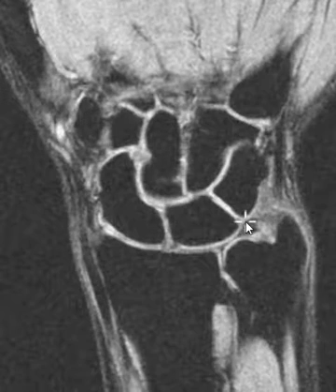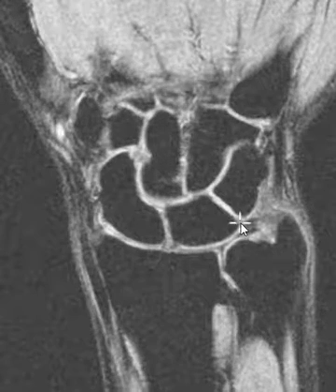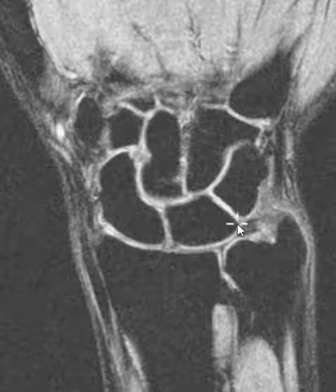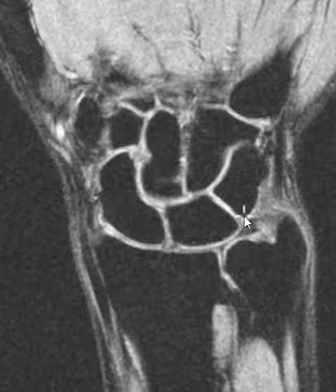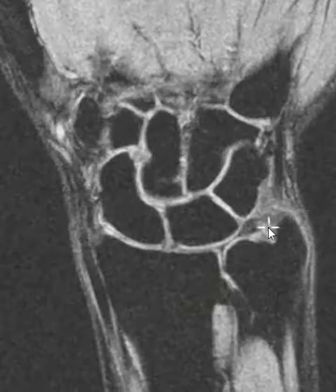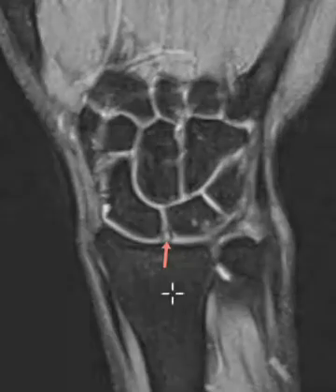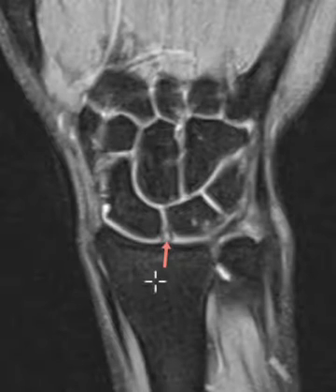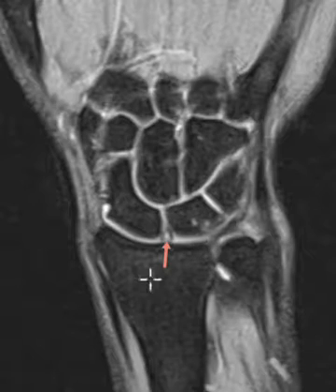There may be some limited intact palmar fibers, and that's why it's not widening yet — but this is a scapholunate ligament tear. The lunotriquetral ligament is over here. You can kind of imagine a little gray glob here. Normally it's very difficult to see, and as long as the relationship is maintained, you can say you think you see that lunotriquetral ligament. One more view: this is a PD fat sat coronal, and you can see that scapholunate ligament tear right there.